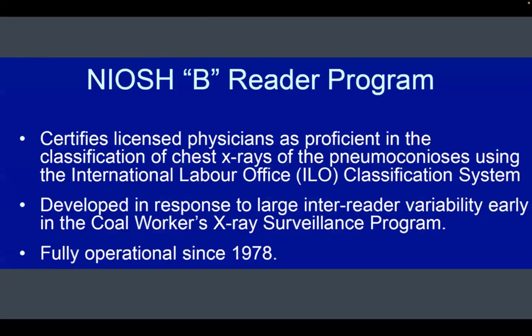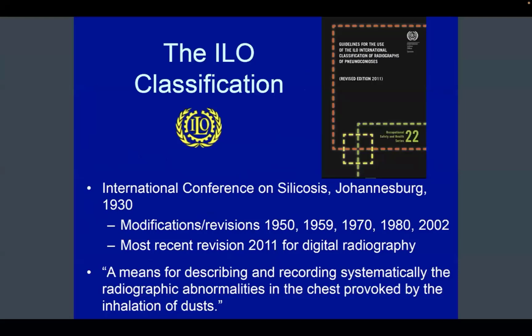So this is giving an outline of the NIOSH B Reader program. It's been around for a little over 45 years, and they utilize the International Labour Office, or ILO, classification system. Next slide. This is just providing some background about the International Labour Organization's paradigm. Next slide.